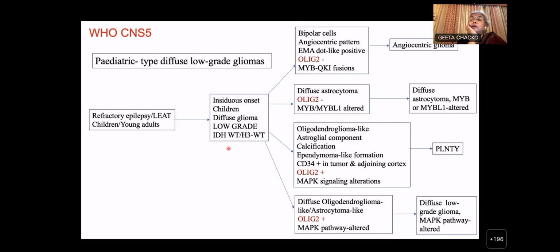No, ma'am. So to summarize, here the main thing is identifying a low-grade tumor compared to a high-grade tumor. So all the features that make it low-grade in terms of cellularity and proliferation and so on. And then remembering that in a child, the diffuse gliomas, even if they have the morphology of an adult-type tumor, are actually CNS grade 1 tumors. And they're entirely different entities which can be picked up, which can be diagnosed either with immuno or molecular testing.